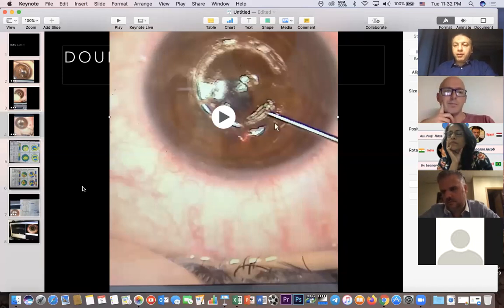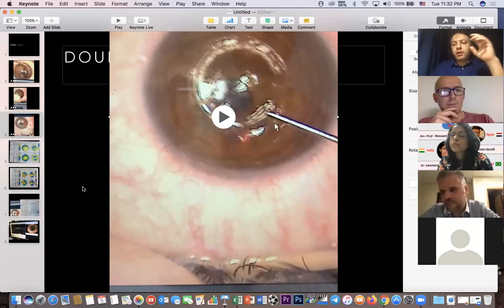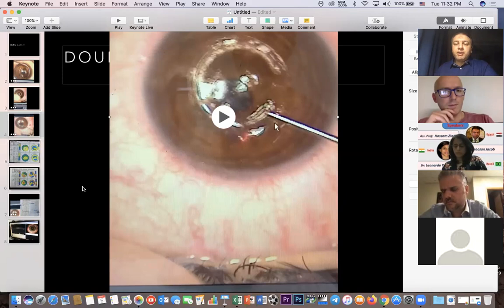You can induce aberrations. About the case, Leonardo, she has inferior steepening of more than 2 diopters between the superior and the inferior points. The keratometry reading in the superior point was 45, then 42, and in the inferior point was 47. So with very high posterior elevation in the corresponding point, I considered her as keratoconus, even an early keratoconus case, but still having good vision, not just astigmatism, because there was an asymmetrical bow tie, not a symmetrical one, with posterior elevation. This was after removing all false negatives and positives, after repetition of the Pentacams for her.